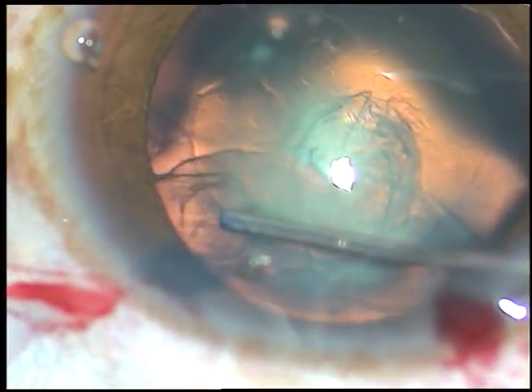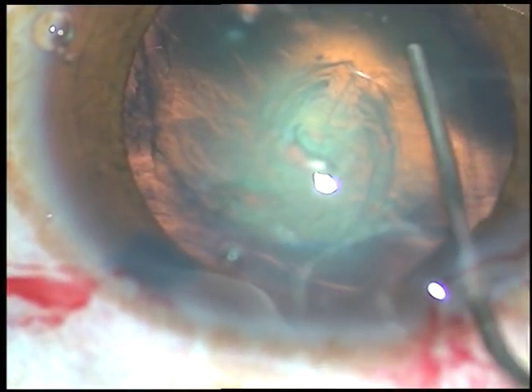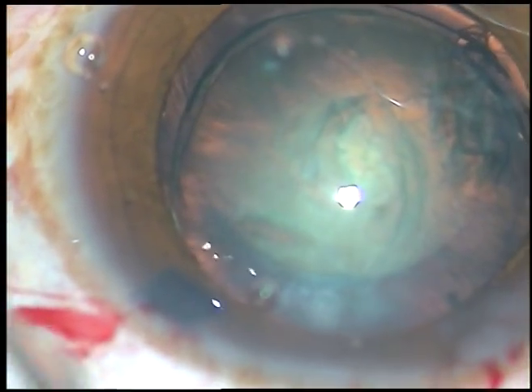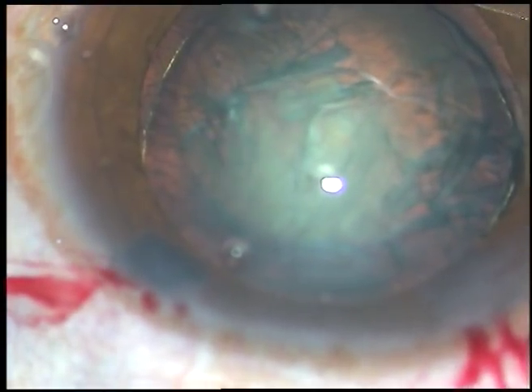This is hydrodissection — see the fluid went to the other side. Now this is hydrodelineation and it has produced a golden ring. This golden ring separates the nucleus from the epinucleus.